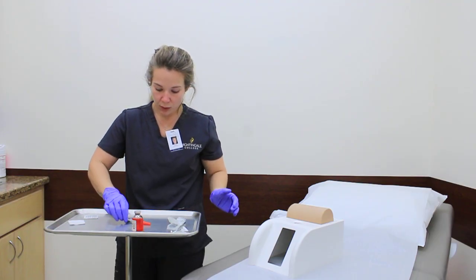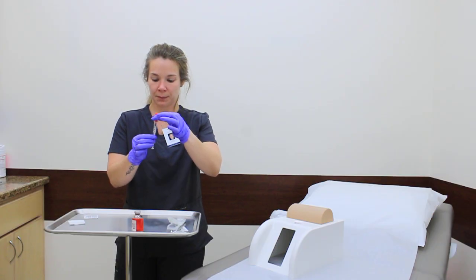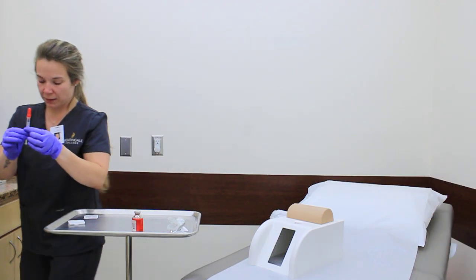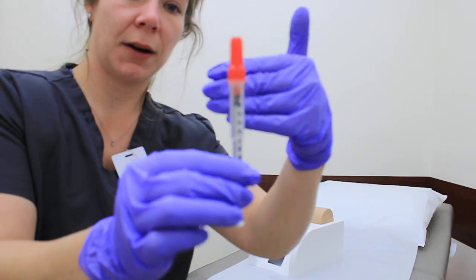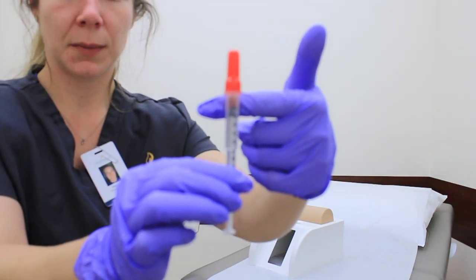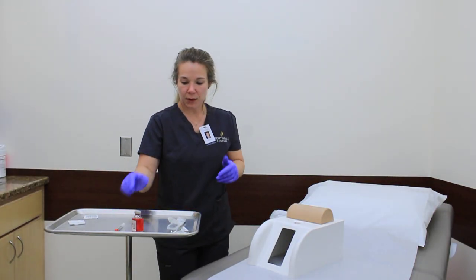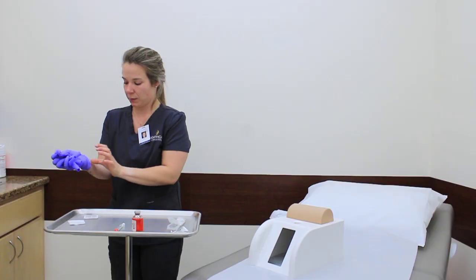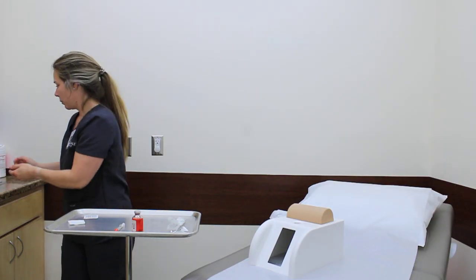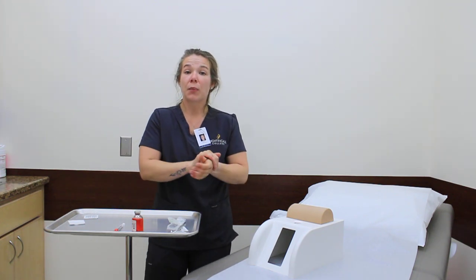And we're gonna use the one hand scoop method to recap the needle. Oh, I need to verify with the camera. So here is the 0.1 with no air bubbles. Perfect. I'm going to remove these gloves. Perform some hand hygiene. And then the next thing I need to do is prep the skin, and then we will perform the injection.